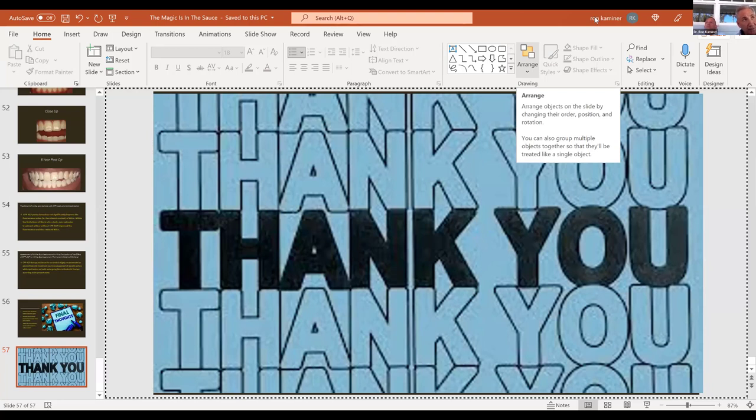So first off, the question is, does fast curing create more stress and strain? That's the first question. Okay, so you get a complete cure potentially faster. I get that, but does it create more stress and strain on the adjacent tooth? I mean, we all know that if you have a self-curing composite, it creates less stress and strain when curing. That's why, when I'm doing a delivery with resin cements in the posterior, I love dual cure, because you can almost let it cure slowly and have less stress and less strain. So I do look at it that way.